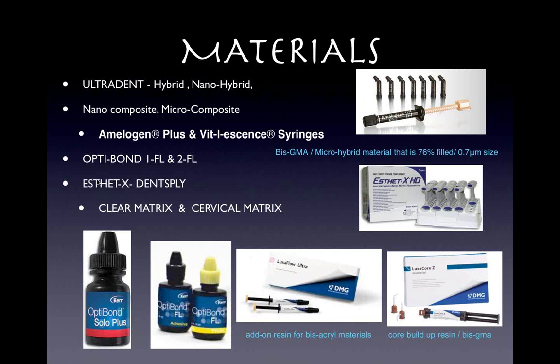The curing light also is an issue in terms of, are you curing the light instantly or are you curing it slowly? Definitely, tomorrow, the biggest tip I can give you is take your curing light and go ahead and use your monitor and measure it and make sure that it's curing in the right position. So we don't believe in an incremental cure, we believe in a full cure, and we really go up to 30 seconds with our cures.